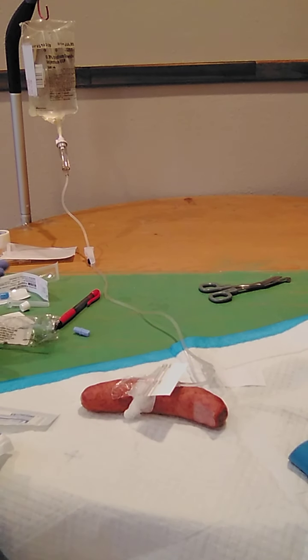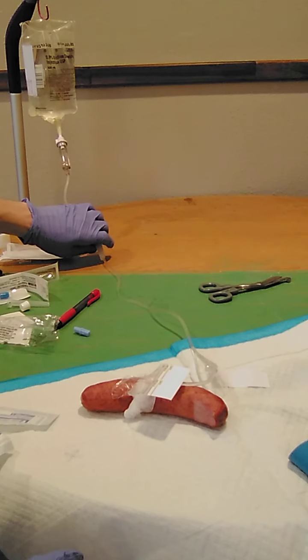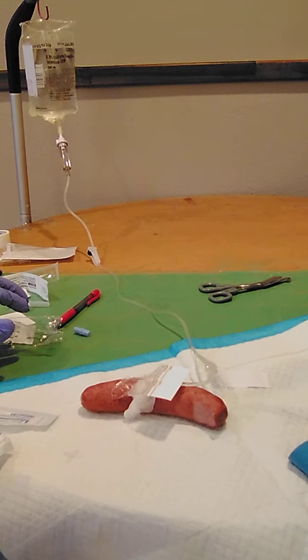So I'm checking lastly that the infusion rate is as specified in the order and the medication administration record. I'm going to write what I did in the medication administration record when this began.